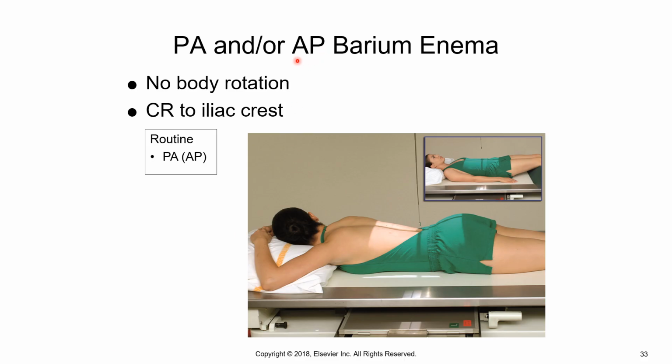Next our protocol is AP barium enema. Okay, so the AP barium enema is on page 527. You're still at a 40-inch SID. You're still on a 14 by 17 portrait, assuming your patient fits that way. Your technique, I know you're going to be shocked, but it's 110 at 2 for single, 90 at 2 for double or water soluble. Patient lies on their back.